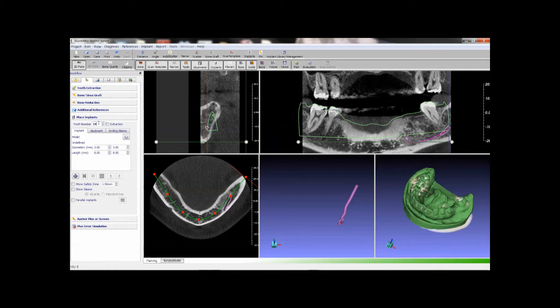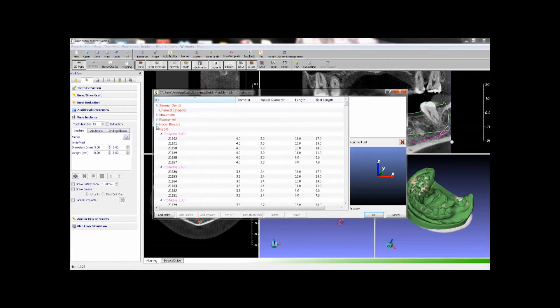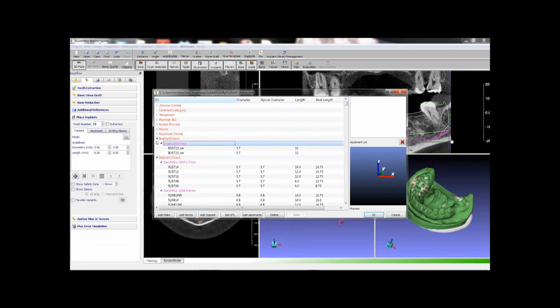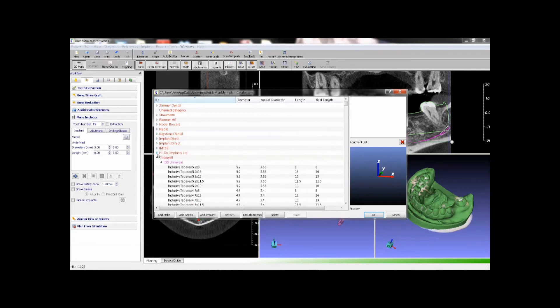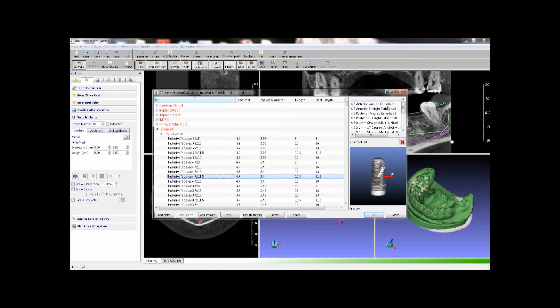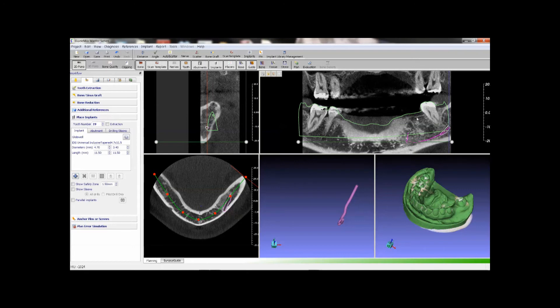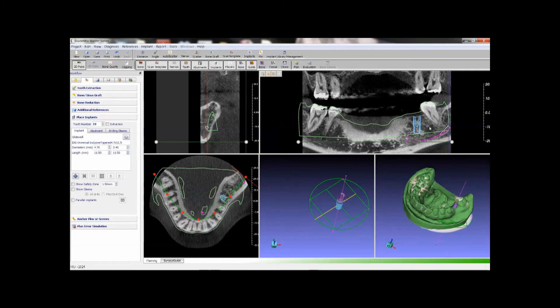Give a tooth number, click implant library button. This is the library management tool. Implant manufacturers and their implants are shown here. Please notice we do have tools in this dialog to add new implant makers and their implants to the library. For this case we want to choose an implant from Glidewell, choose the compatible abutment. Click the add button.